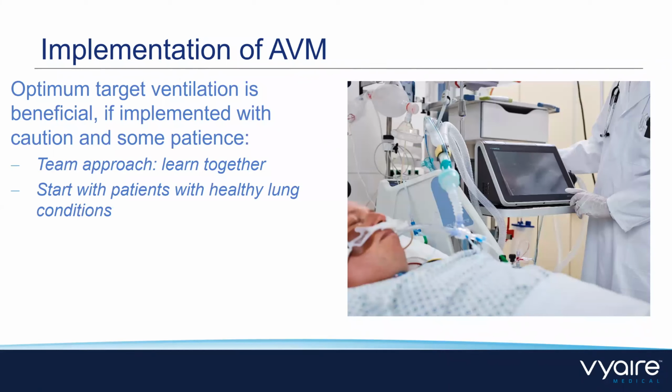I would always suggest to start with a healthy lung condition patient, just that you can learn on what AVM is doing and how AVM is changing the course of ventilation. And then get experienced when you are comfortable with AVM to ARDS, lung injury patients and COPD patients.